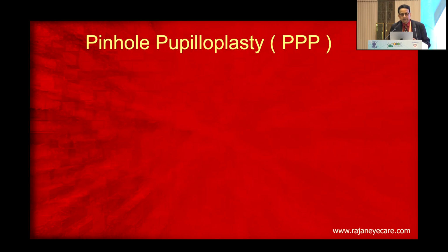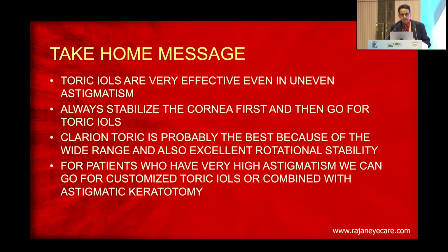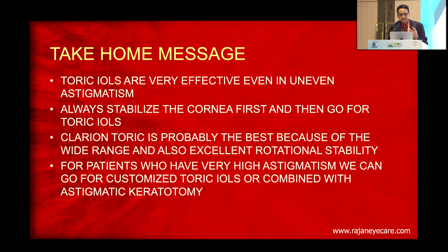Then I spoke to Amar and he said, why don't you do pinhole pupilloplasty? Pinhole pupilloplasty is something which is very good in these cases. So I did a pinhole pupilloplasty, brought the pupil to about 2 millimeters, and you can see that the patient did very well.